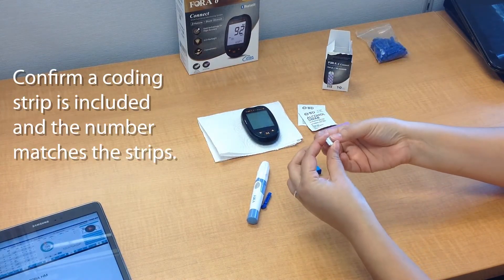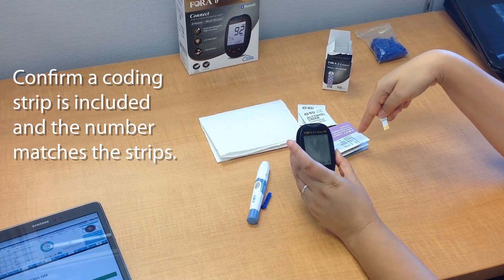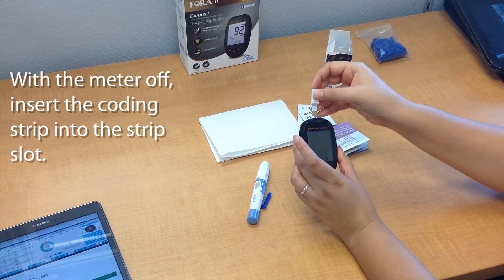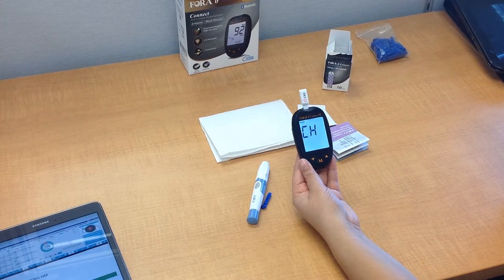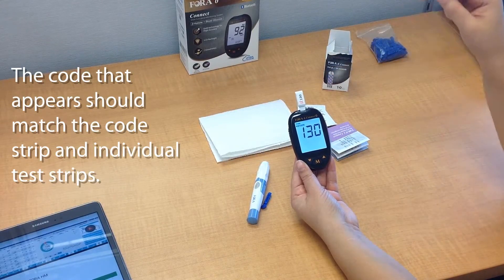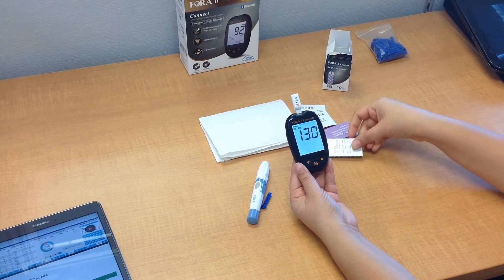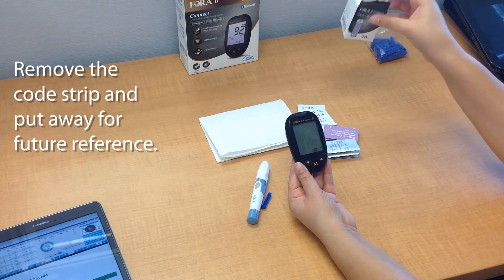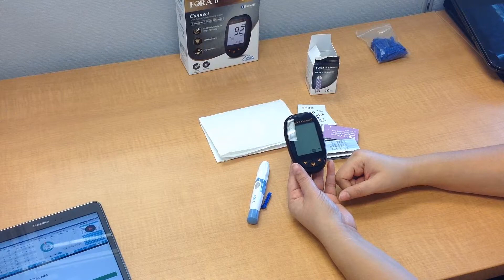This coding strip allows you to code the meter and ensure that the number on the coding strip matches what's on the meter and the testing strips — that's really important to make sure everything is accurate. So with the meter turned off, go ahead and insert the coding strip into the test strip slot, and the code should come up. It's 130, and it matches the strip and the other test strips. Once that's done, you can remove it and put it away. Don't throw it away because you might need it for reference in the future. Once you remove it, the meter will turn off automatically.